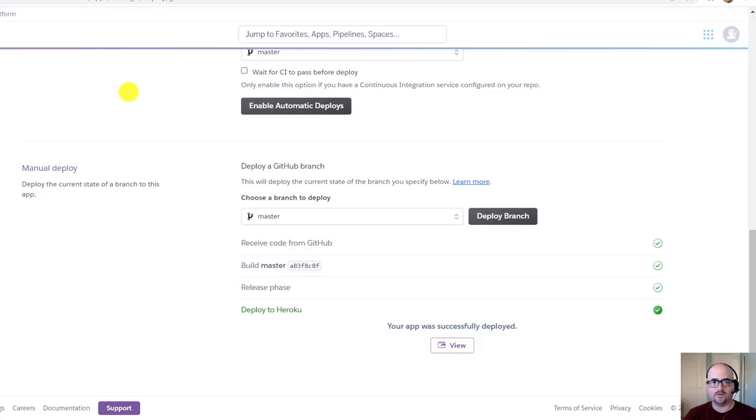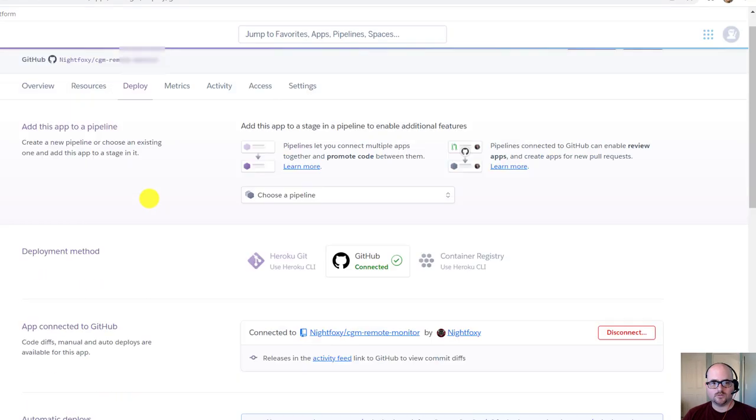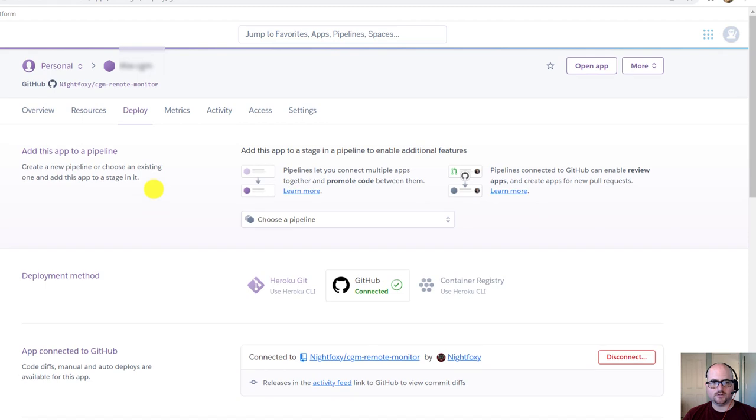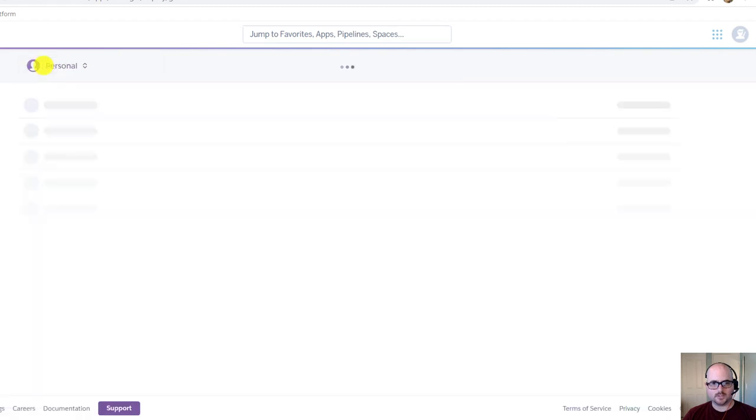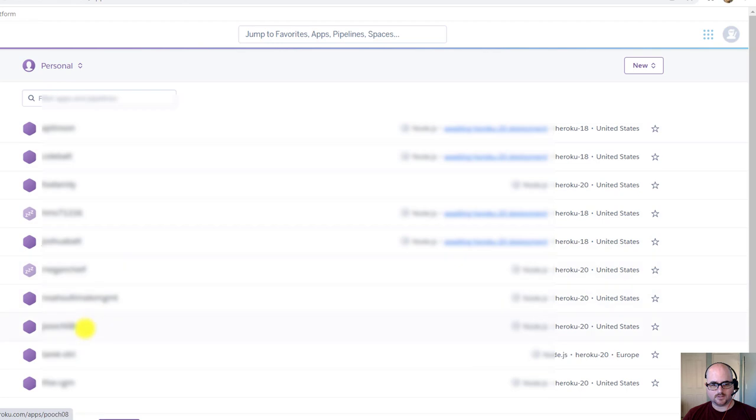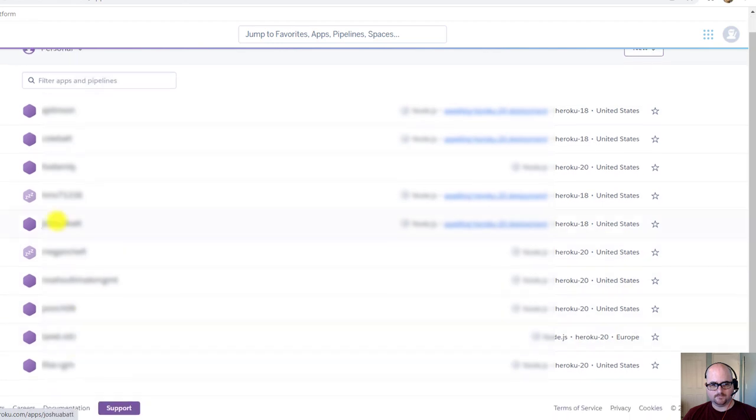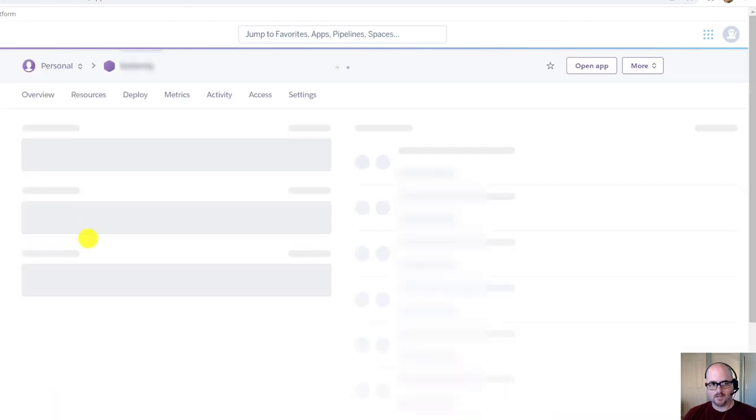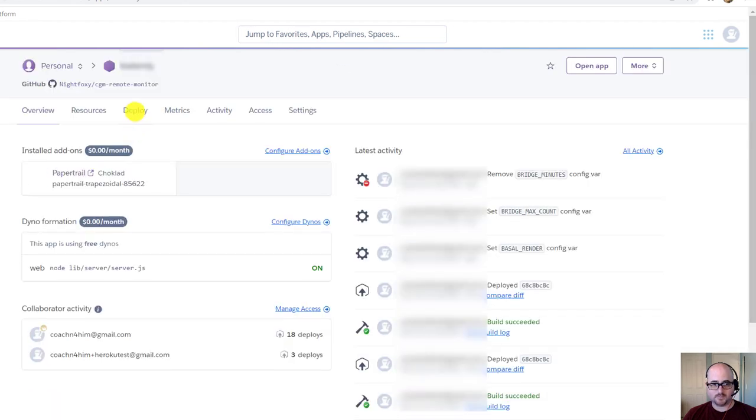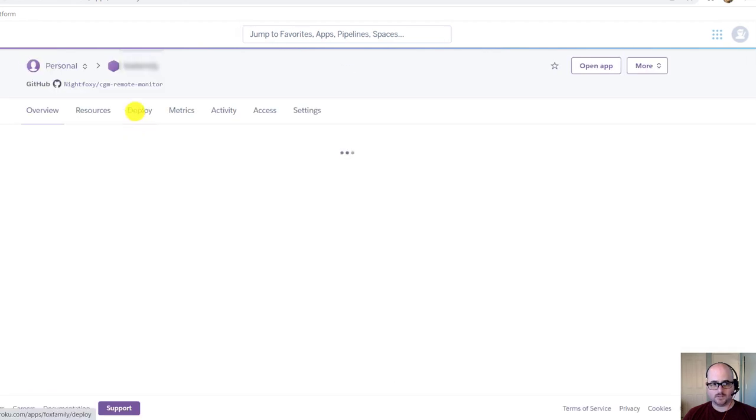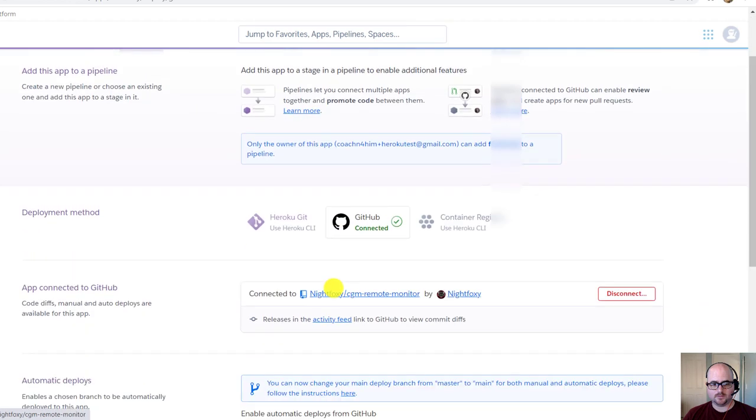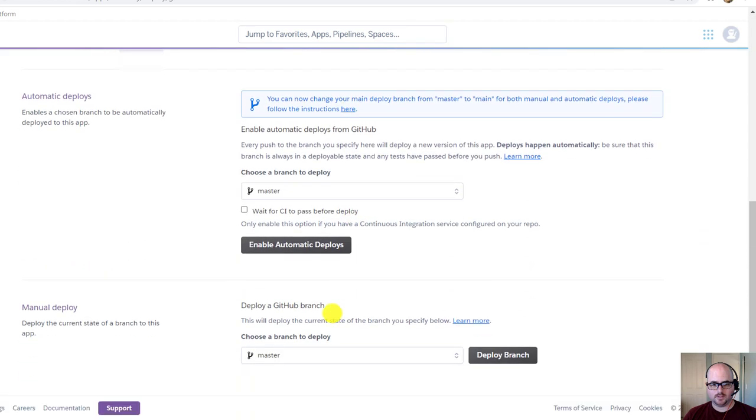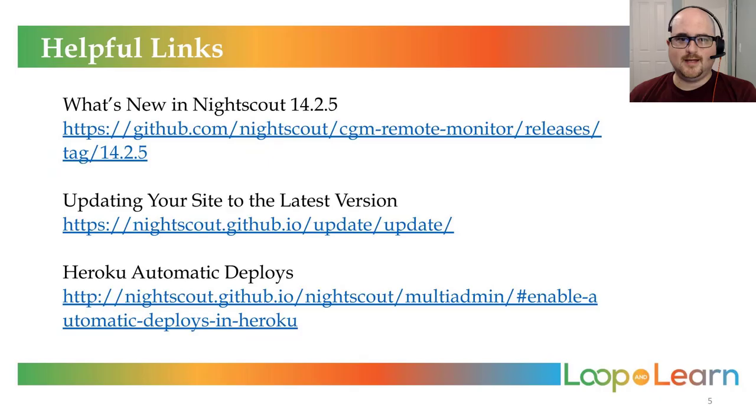If you have other sites to update, you can scroll up in Heroku and go back to the Personal section, and then select another site to update and follow the same steps. Deploy, go down to the bottom, pick Master, and Deploy Branch. And that's it. That's how you update Night Scout to the latest version of the Master Branch.